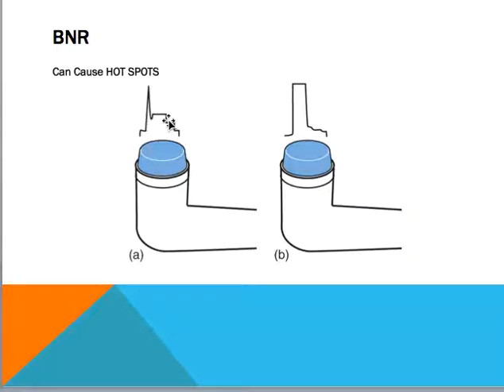You could move the ultrasound off of a bony prominence area, so maybe you're close to a bone and that sound wave is resonating off of the bone, and that can become painful, so just move the ERA over so that you're not on bony tissue. And then the last thing is probably wise that you get the machine checked and recalibrated if people are complaining of pain during an ultrasound.